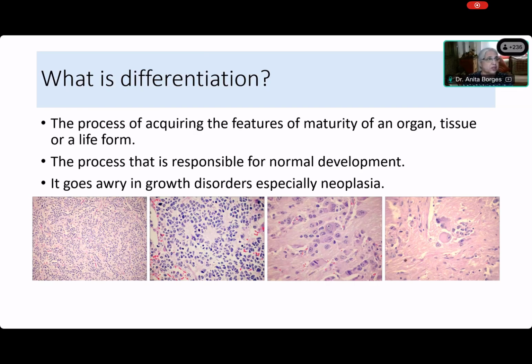There are some people in the chat box saying there is no glandular lining. And what is it then? So actually, you don't see an epithelium. Glands usually have columnar epithelium. So you're not seeing an epithelium. Very good. Sometimes we have to define epithelia, etc. It's not a gland for a very good reason.